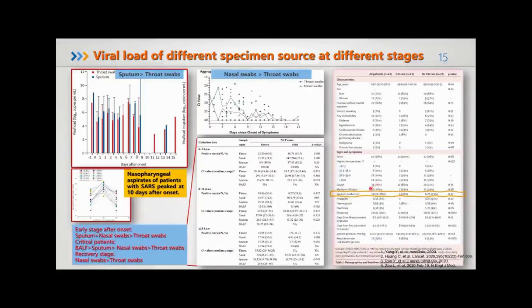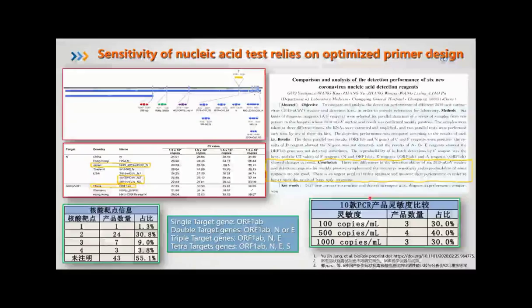But only 28% of patients have sputum production, but the others had only dry coughing. Secondly, the performance evaluation of nucleic acid amplification tests should not be neglected, especially for the lower viral abundance samples.